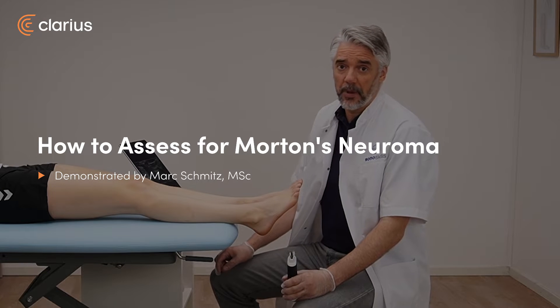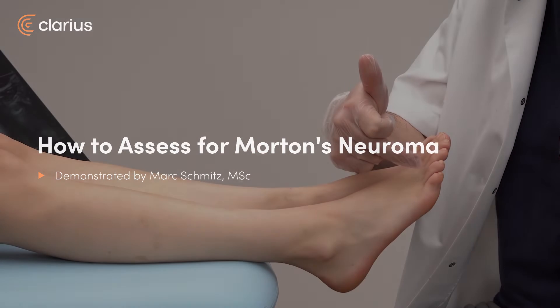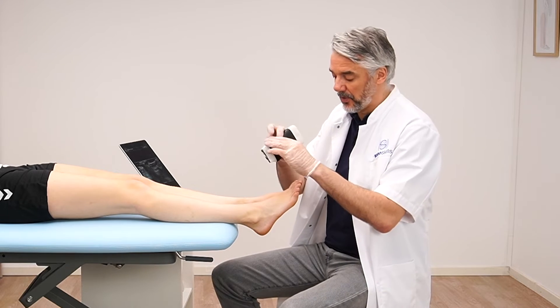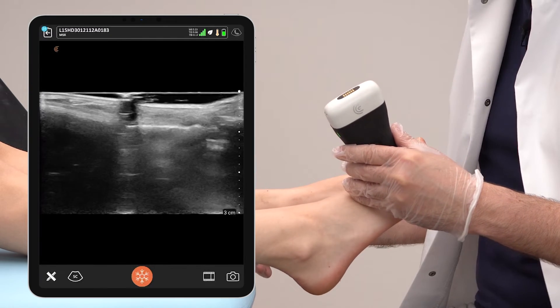When suspecting a Morton's neuroma, we can also scan in between the third and fourth metatarsal bones in this web space. Patient is in a supine position and we place the transducer in between this third and fourth metatarsal web space.